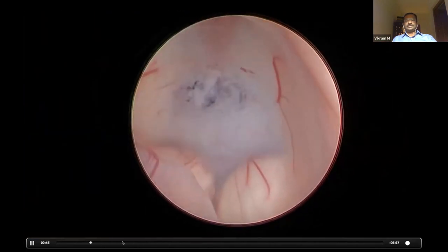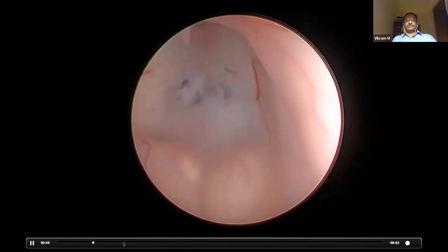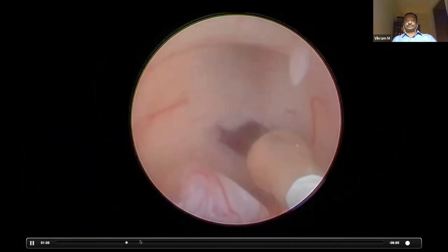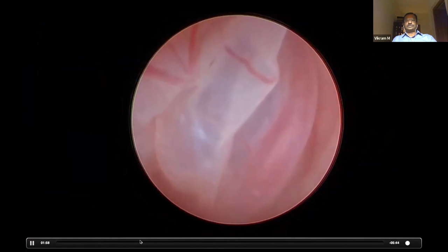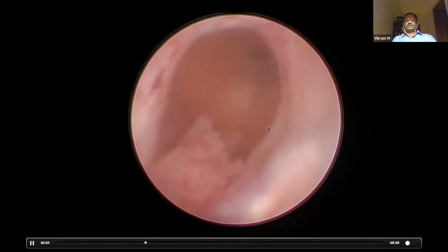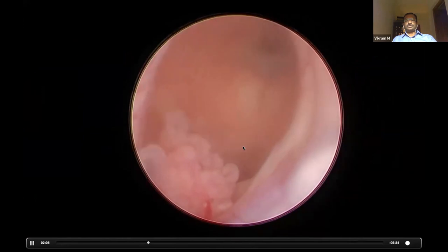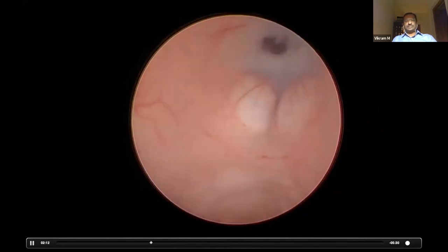which is as standard as everybody does it, opening the membrane and then dilating it, followed by this. It has a huge venous channel along with it on its surface, and so I was not sure whether excising it would cause some thalamic infarct or whatever.